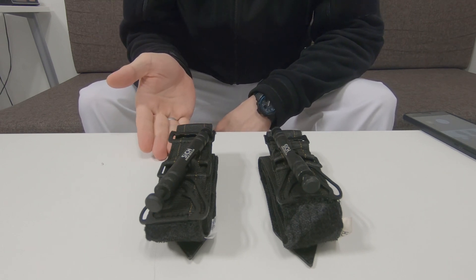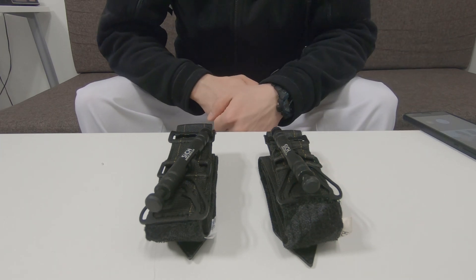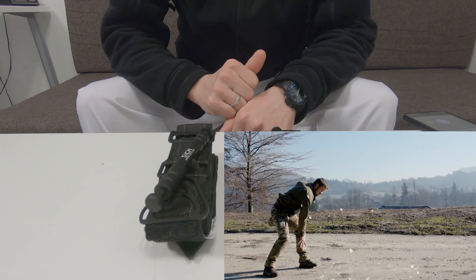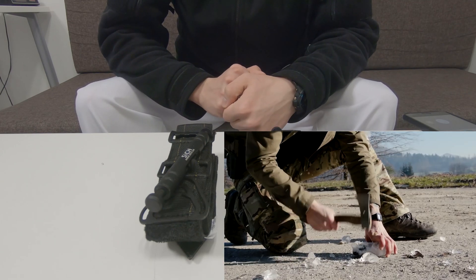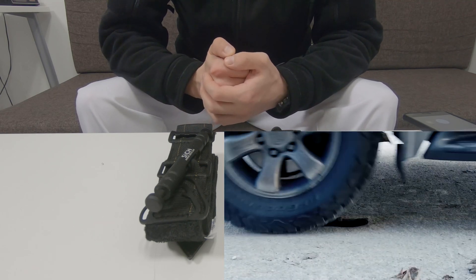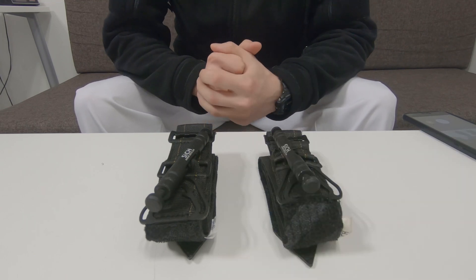This one is brand new, and this one is the exact tourniquet that has been used for testing under extreme conditions. It was frozen for three days at minus 25 degrees Celsius, smashed by blood side of X multiple times, used four times to tow a car, and then driven over twice by a Toyota Land Cruiser which weighs almost two tons.